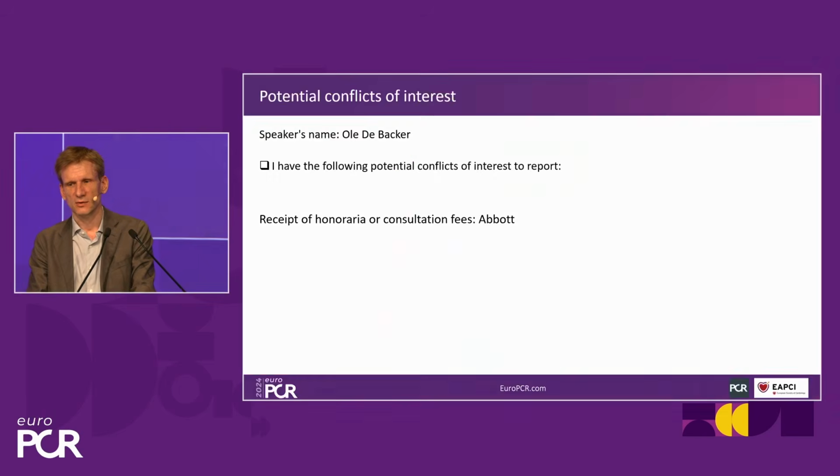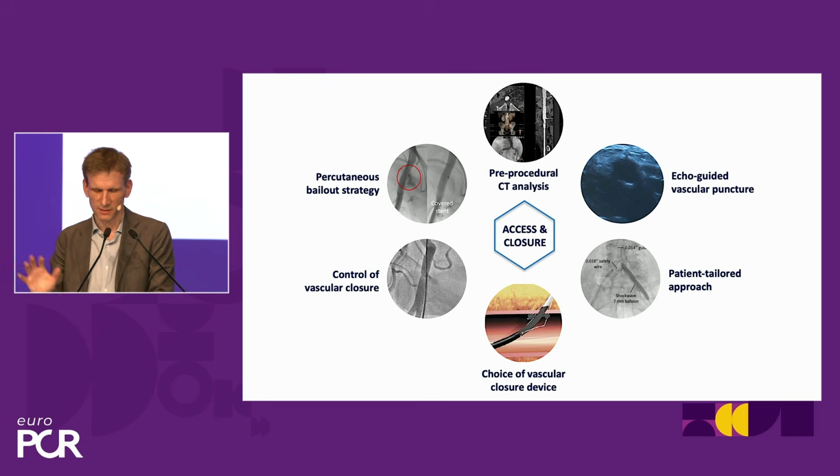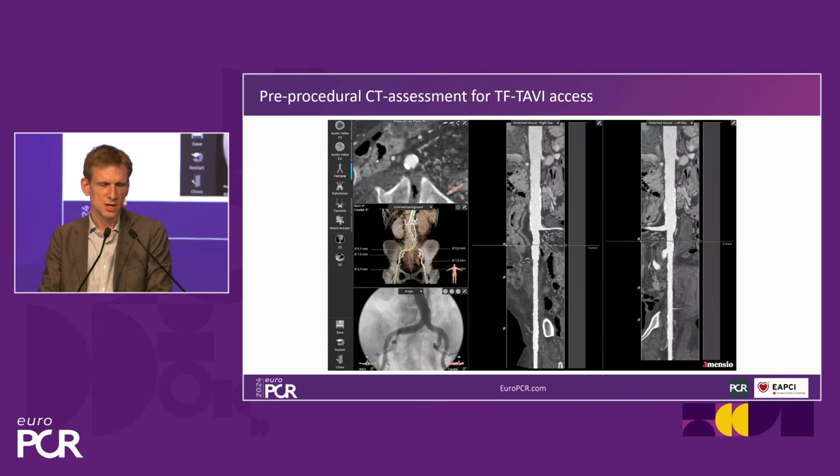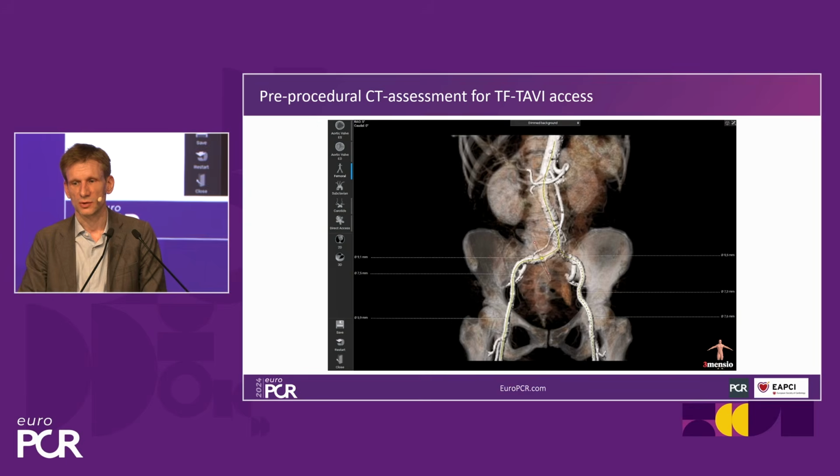So it starts first with a good access, yes? And indeed, what do I understand by a good access? Well, again, it frames into a bigger context. So it first starts already with a CT. We all have a CT, so this is in the context of TAVI. If we do the TAVI, we typically have a good CT.